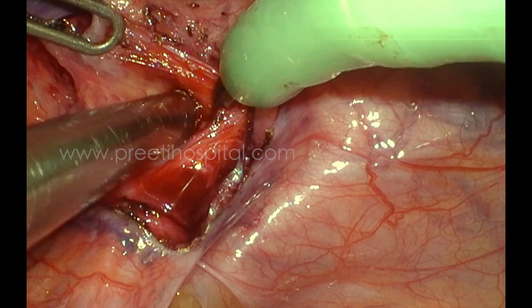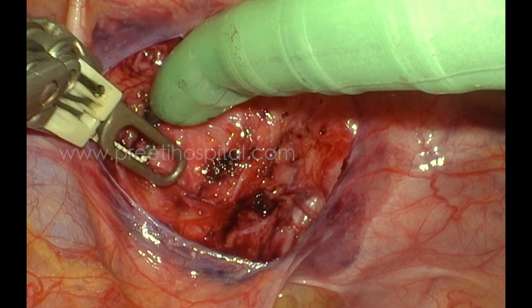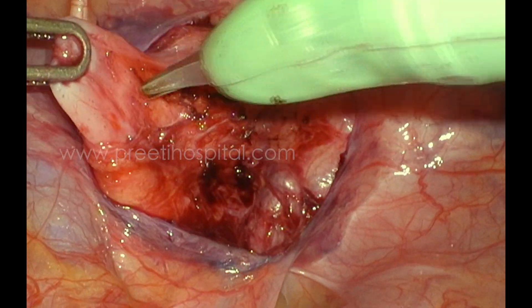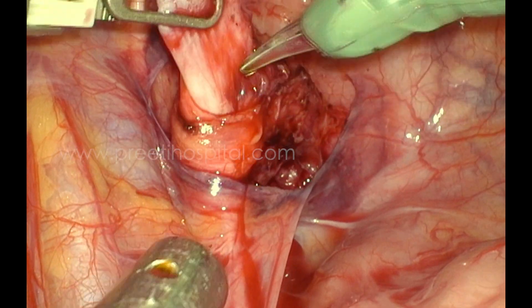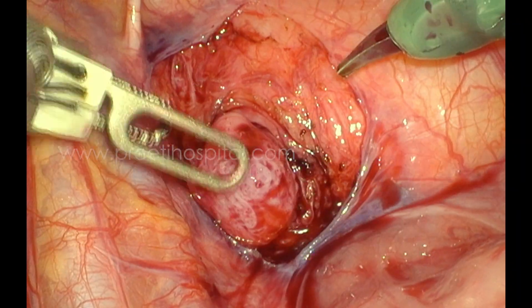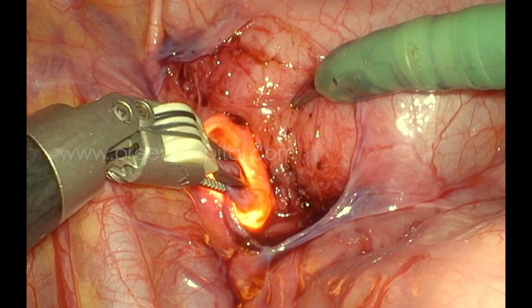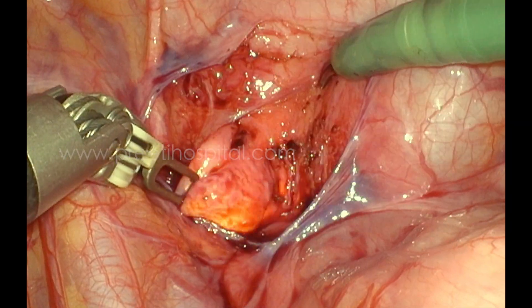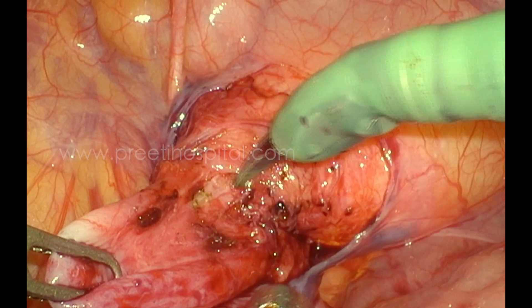The white color of the diverticulum wall, clearly lacking any detrusor muscle, is clearly seen. We proceeded confidently without cutting any detrusor at all. The ureteroscope light is now visible inside the diverticulum, and with the bladder distended you can appreciate this is clearly away from the ureteric orifice.